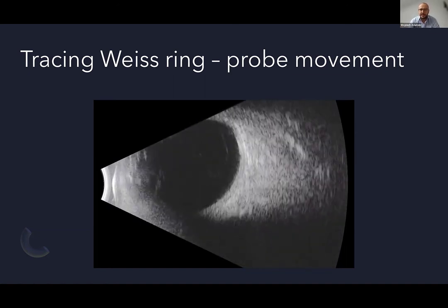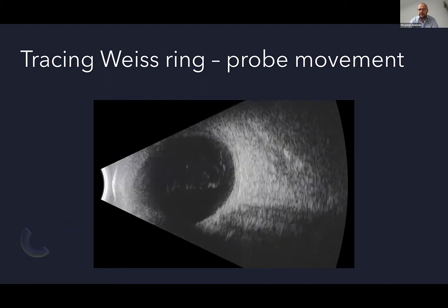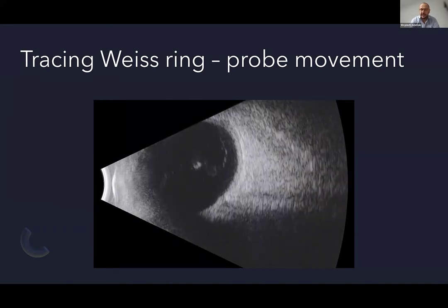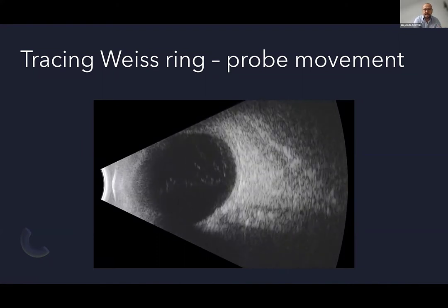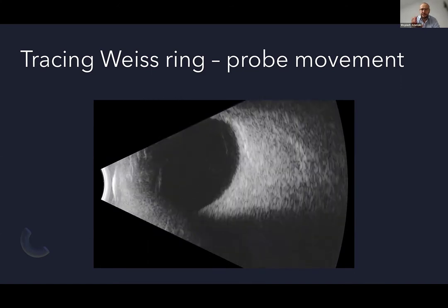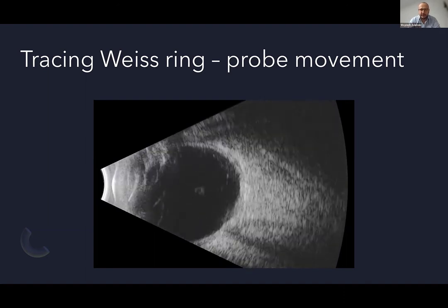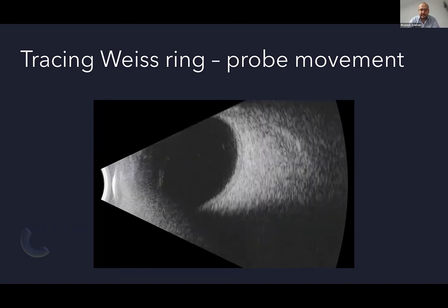What I mean is that based on the position of the probe, we can achieve different images of the vitreous and of the anatomical situation in the eye. In short, we can do this examination when we've got a large floater shown on screen, but we can also have some frames of the image without any floaters or without any significant floaters.